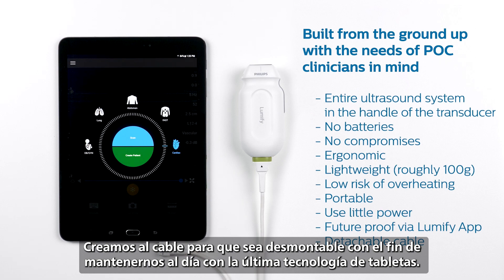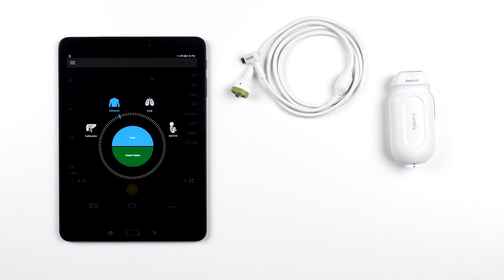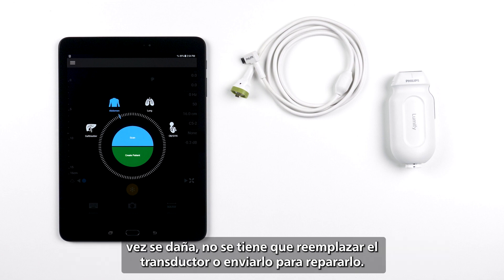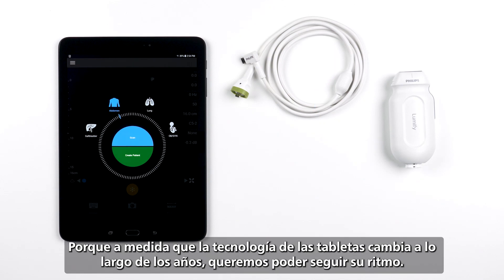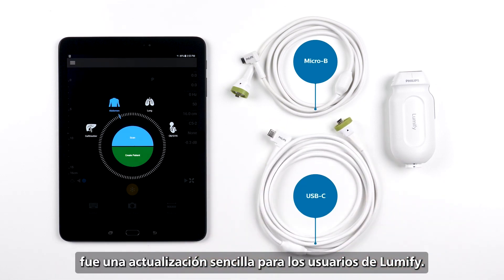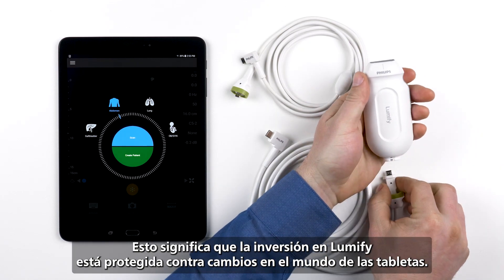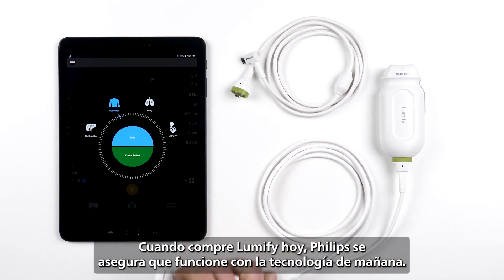We created the cable to be detachable in order to keep up with the latest tablet technology. This is helpful for two main reasons. One, point-of-care ultrasound users are in all sorts of different environments, and if this cable ever gets damaged, you don't have to replace the transducer or send it in for repairs — all you have to do is attach a new cable onto that transducer. Two, as tablet technology changes over the years, we want to keep up with it. For instance, when mobile devices moved from Micro B to USB-C, it was a simple update for Lumify users — they got a new cable from Philips, disconnected the old Micro B cable, and attached a new USB-C cable. This means your investment in Lumify is protected against changes in the tablet world. When you buy Lumify today, Philips will make sure it works with tomorrow's technology.